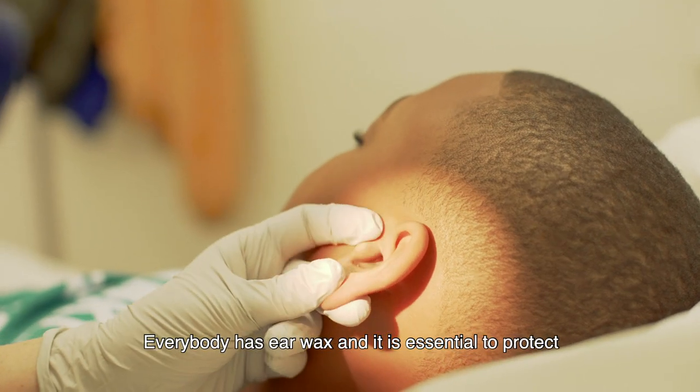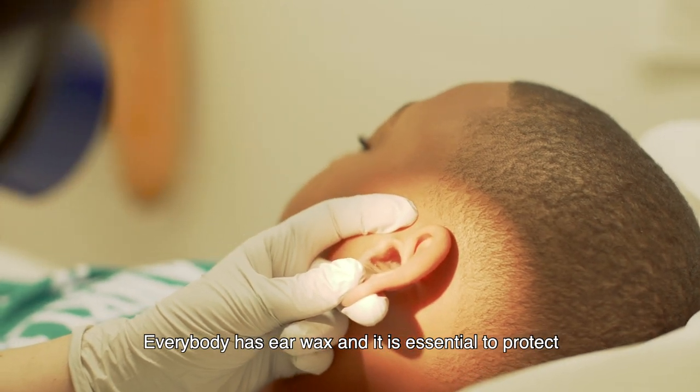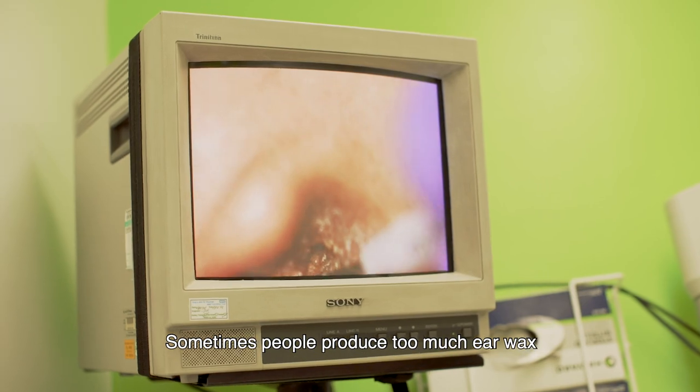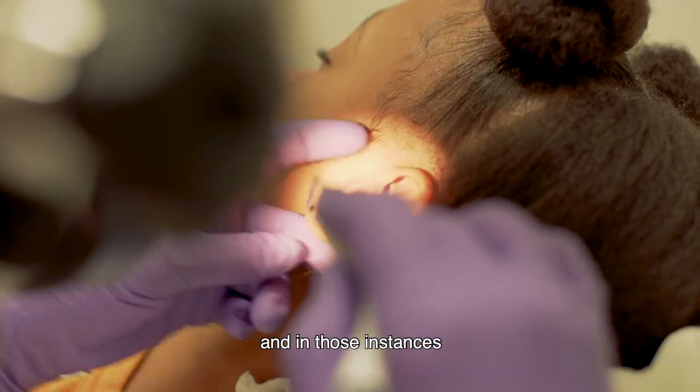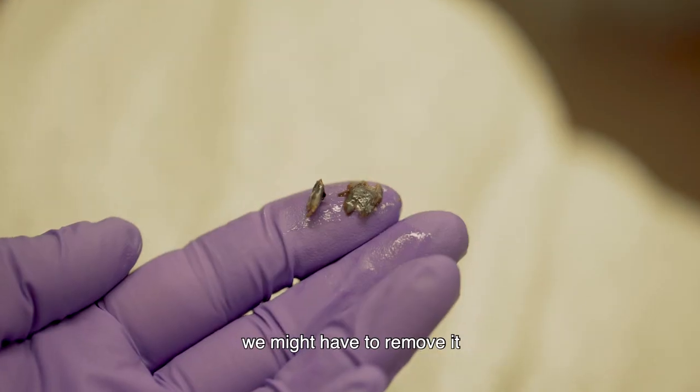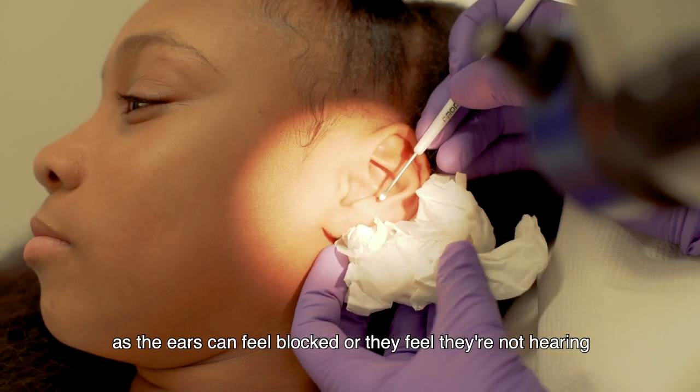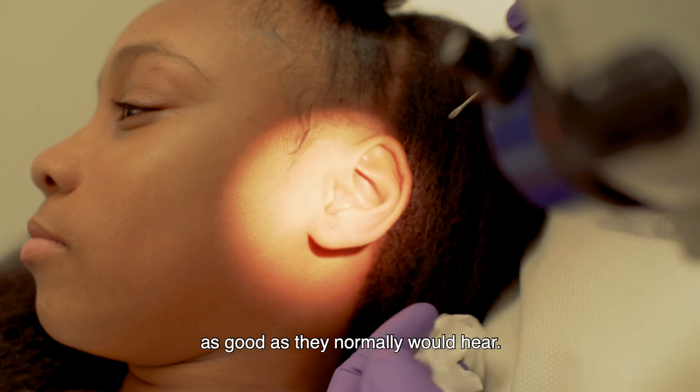Everybody has earwax and it is essential to protect the ear canal from infection. Sometimes people produce too much earwax and in those instances we might have to remove it, as the ears can feel blocked or they feel they're not hearing as good as they normally would.